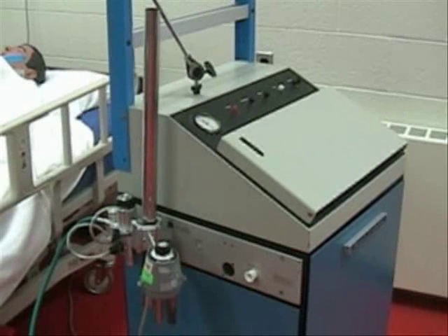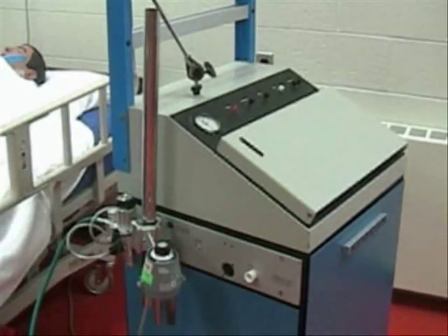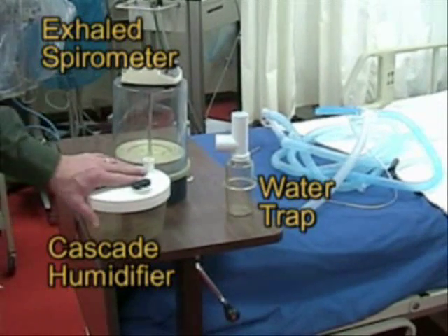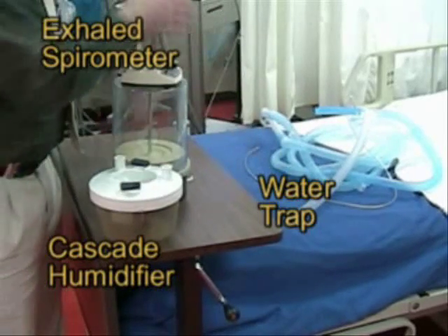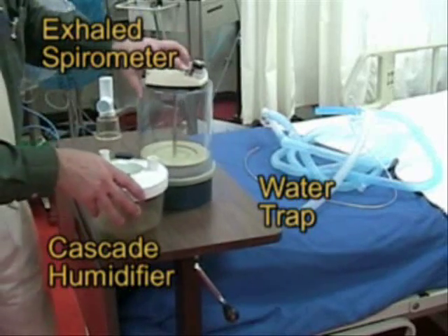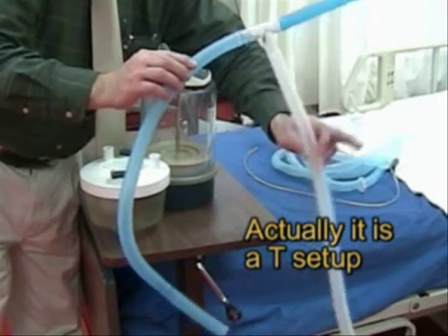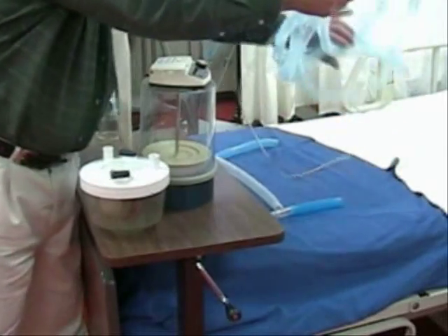When setting up and doing a circuit setup for the MA-1, you want to gather your equipment. You want a humidifier — this is a cascade humidifier — a drain bottle, a spirometer (fully assembled in this case), and an H-setup so that we can connect this to the IMV system. Then you want your ventilator tubing.